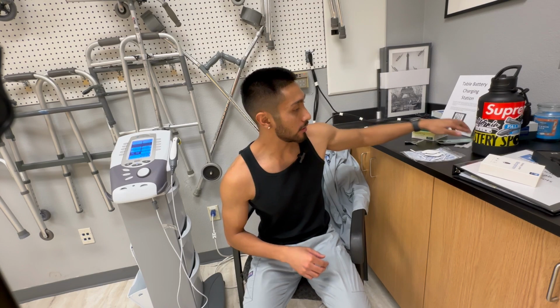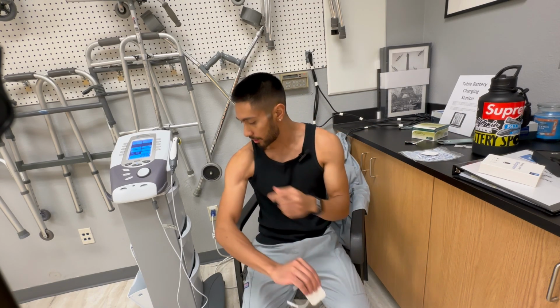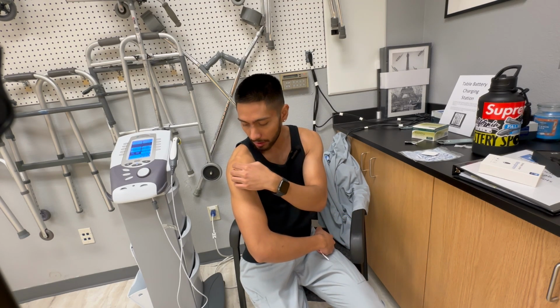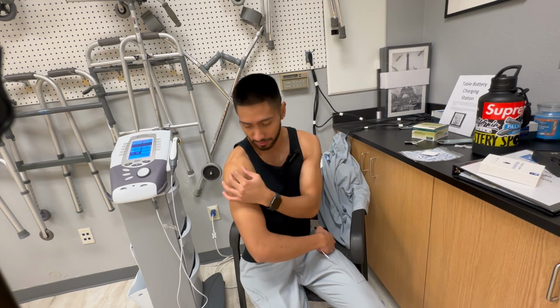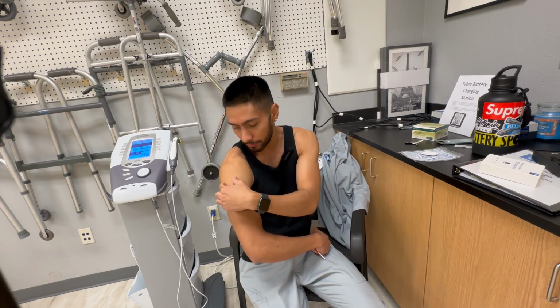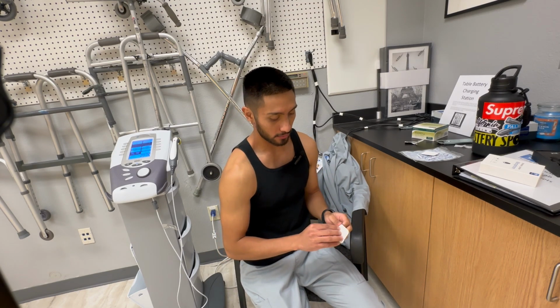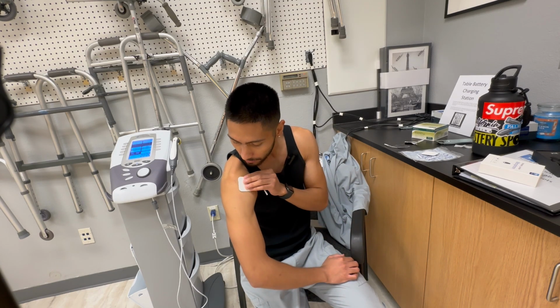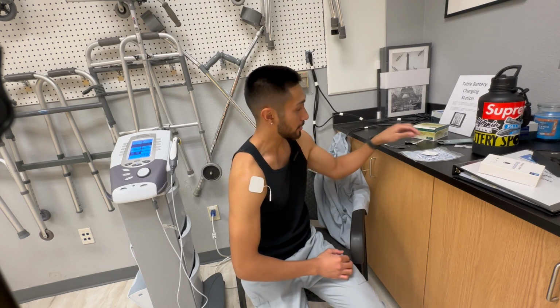Nice and white. We're going to be addressing the shoulder, so we're going to place this in a square pattern, and we want to centralize the region of pain. Right now, I'm having my pain area be around the center of my deltoid muscle. So I'll go ahead and place it just around to where the point of the cross section is going to be in the center. So the middle of the deltoid is going to be my treatment area.